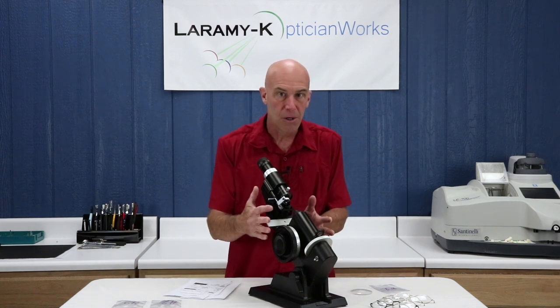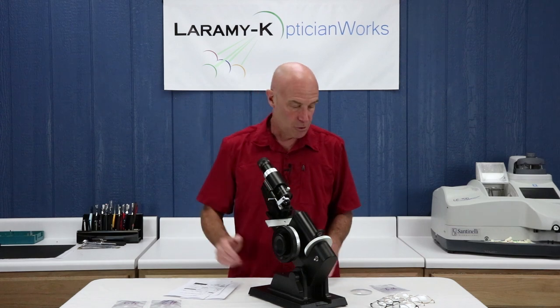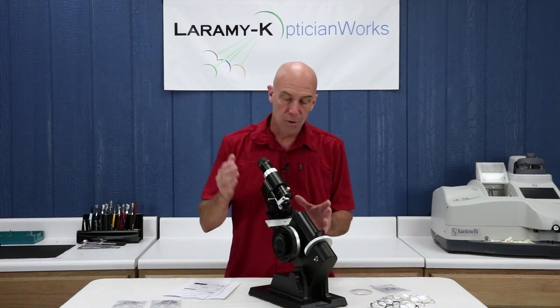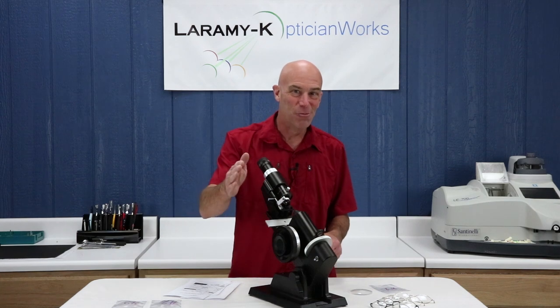Worry about learning the parts, kind of watch what I'm doing and how I'm handling this, and then we'll jump into the kits and start really learning the nuts and bolts of how you work with the lens meter. But first things first — baby steps, foundation, you know me.